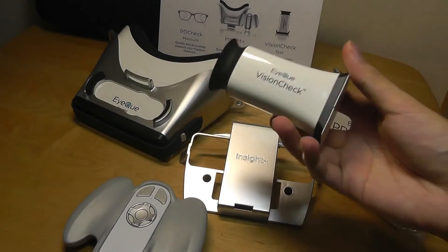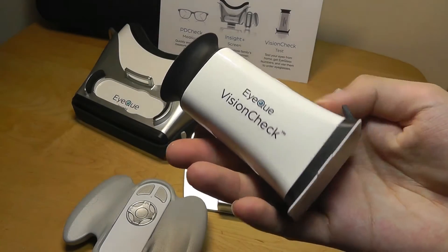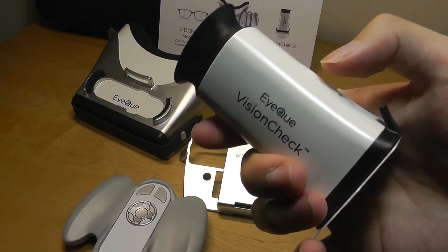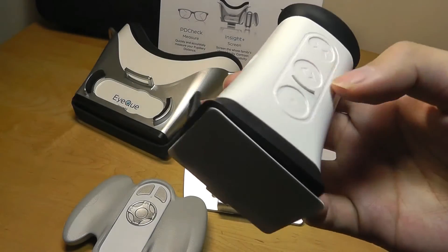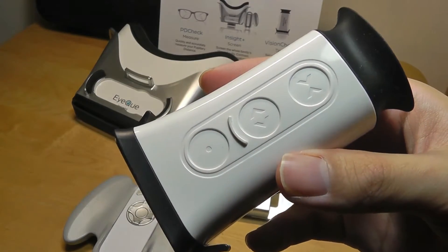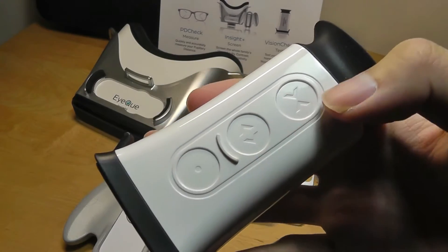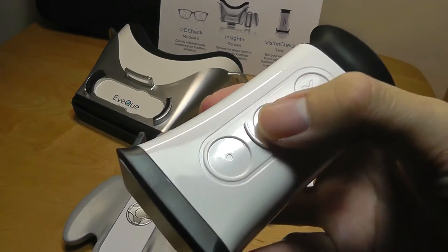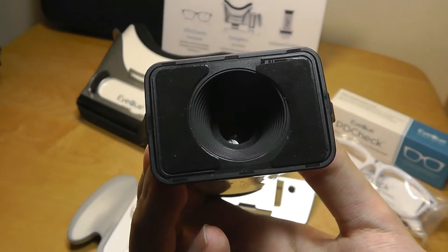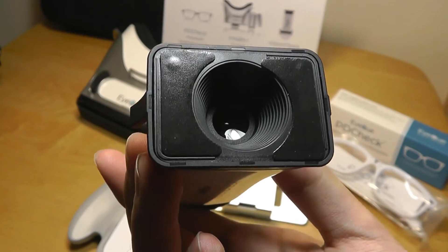Taking a closer look, starting with the VisionCheck system: it uses Bluetooth to connect to your phone and recharges via micro USB. You tap the key for a few seconds to turn it on and pair it. On the very top are touch-sensitive controls. Throughout the test it will ask if you're able to see clearly; if not, you can adjust the focus closer or further by tapping those touch-sensitive keys. The sticky pad attaches firmly onto one spot on your phone screen without leaving a mark, preventing it from sliding around.